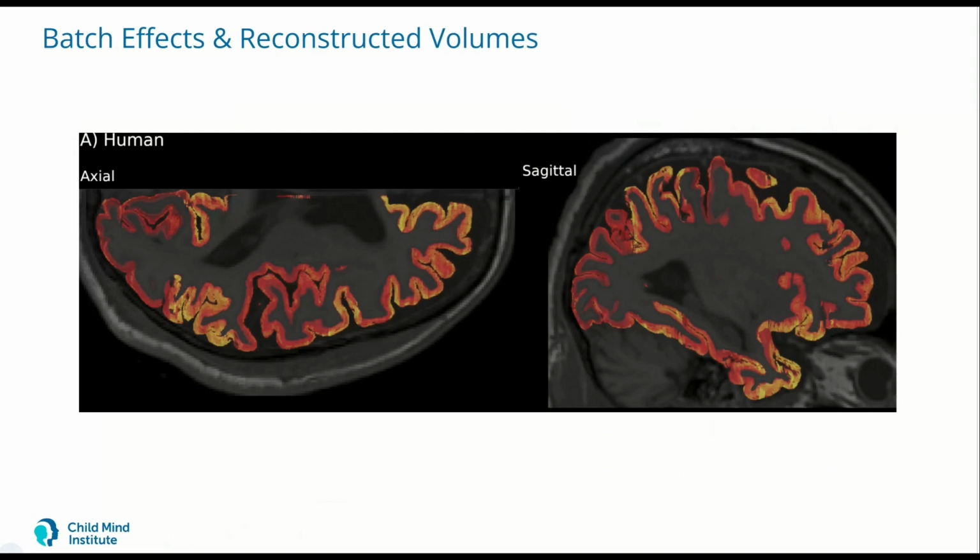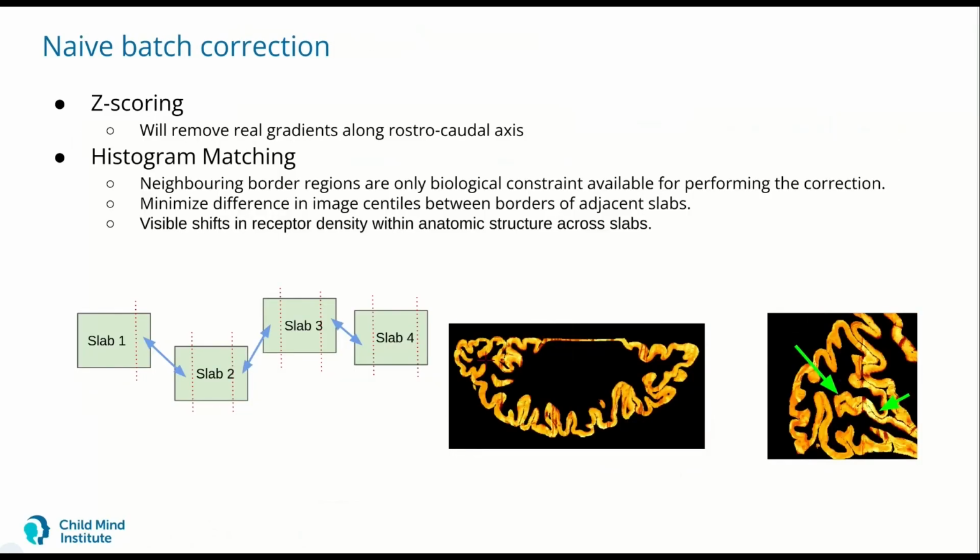So here we have a fully reconstructed image for the flumazenil ligand for the benzodiazepine receptor. You can clearly see that there are shifts in the average receptor density that we measure in different pieces of tissue. There are different approaches one could take to this. One would just be naive Z-scoring, but the problem with that is that if there is a real gradient along the rostrocaudal axis, you would get rid of it with the Z-scoring. Another approach would be to look at the border regions between the slabs of tissue and then try to do some kind of histogram matching or just matching the means or something like that.